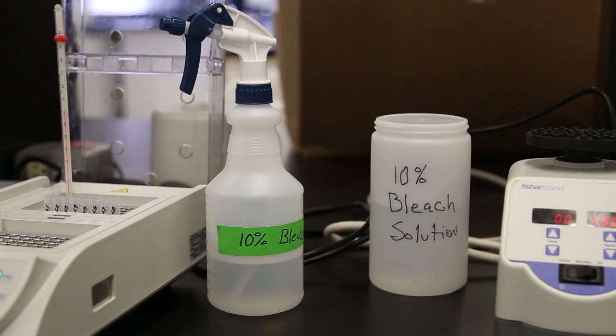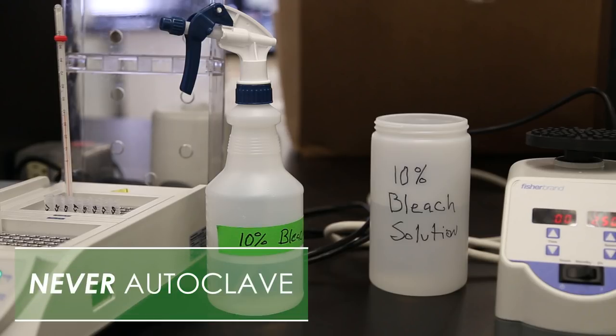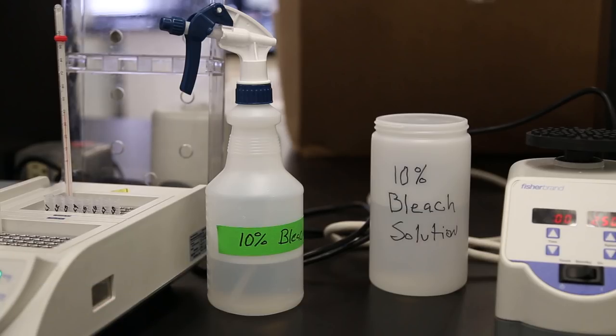Mix up a fresh container of 10% bleach solution daily. We recommend a sealable wide mouth container. The pipette tips and used reaction tubes and caps will go into this solution. A spray bottle with fresh 10% bleach solution is also recommended. We do not ever recommend autoclaving the pipette tips or the reaction tubes.